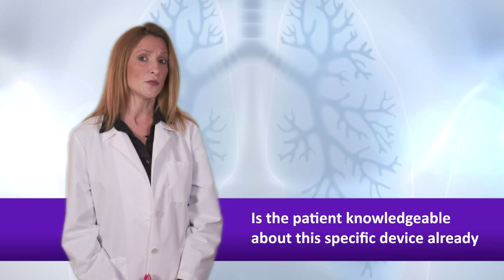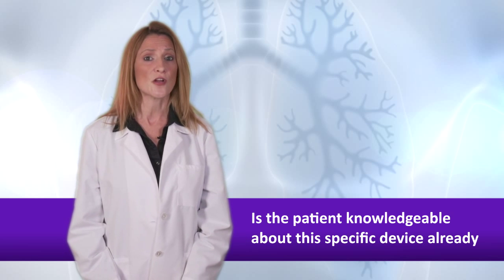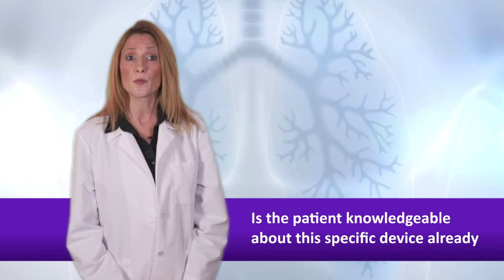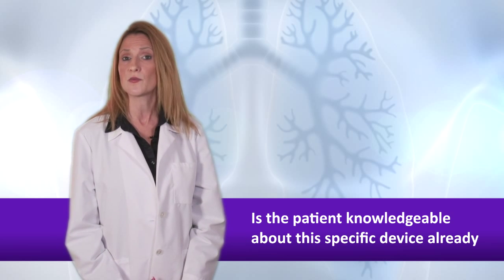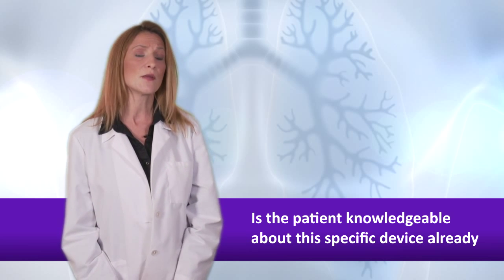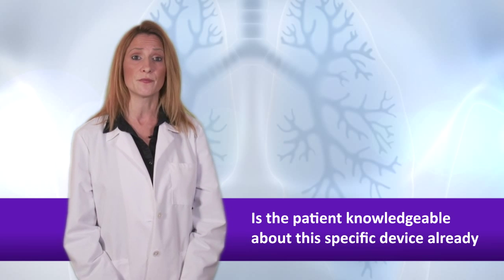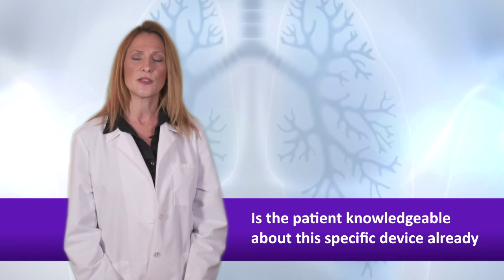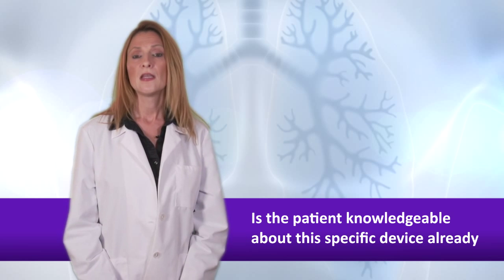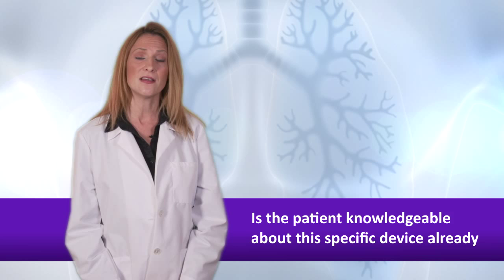Next, is the patient knowledgeable about this specific device already? Check the records for prior prescriptions and instruction with this particular device. If this is a new prescription, has this patient been prescribed a medication using this or a similar device before? If a patient is already familiar with the device, the emphasis for the session can be shifted to assessing the patient's skill with this device versus providing new information. Note which steps the patient had difficulty with in the past. Plan to watch these particular steps more closely. If the patient was already given written educational material, they may not need to receive it again.